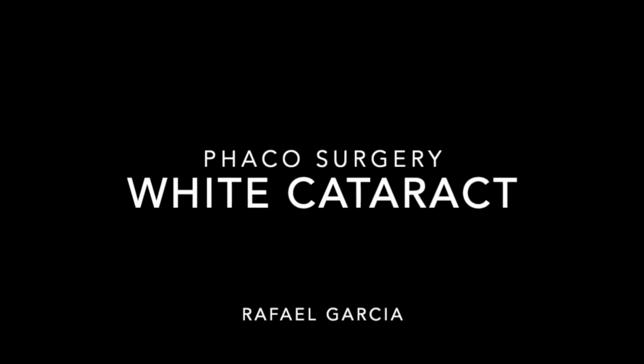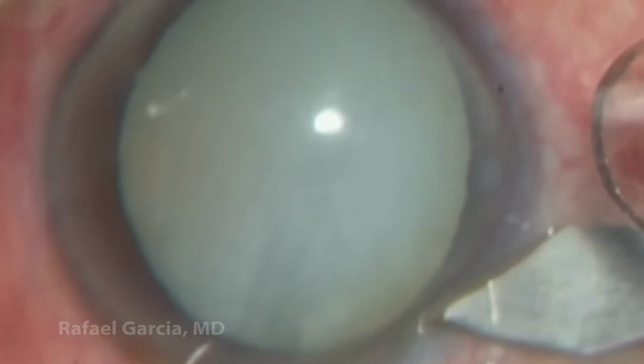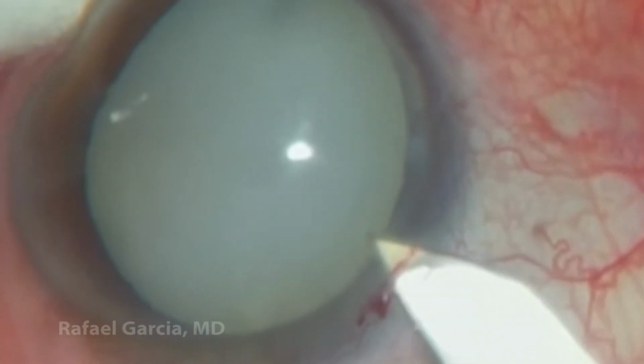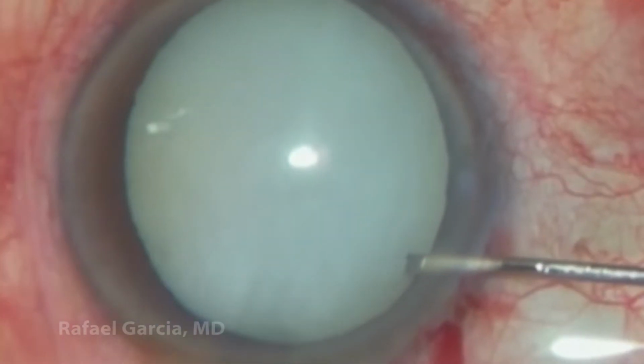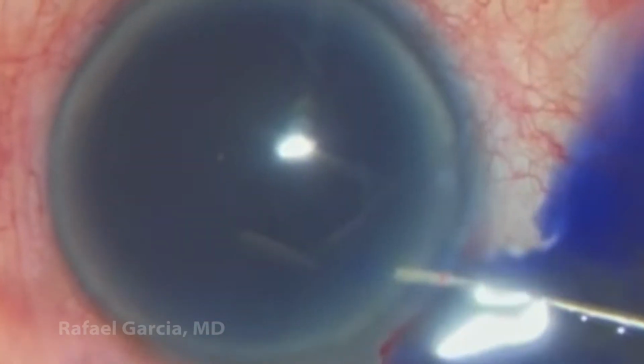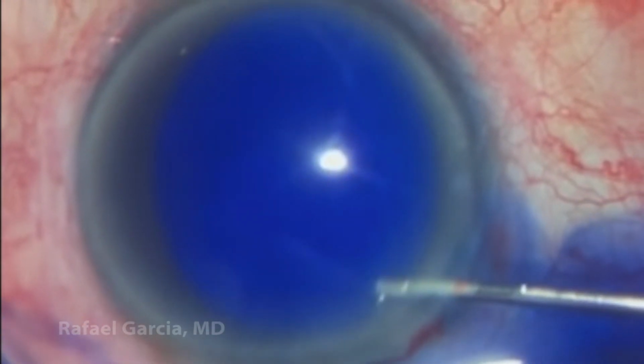This is a patient with an intumescent white cataract. We start this case with a triplanar corneal incision, barely nicking those limbal vessels, and we get a nice tunnel length here with good architecture. This surgery is being performed under topical anesthesia.